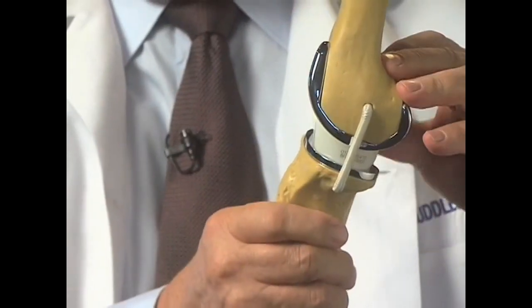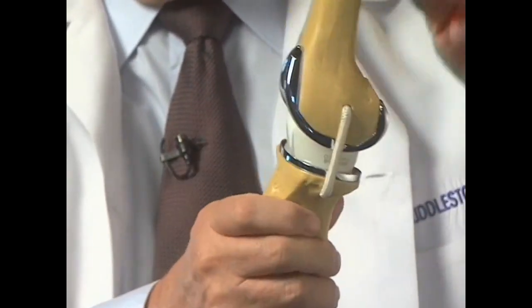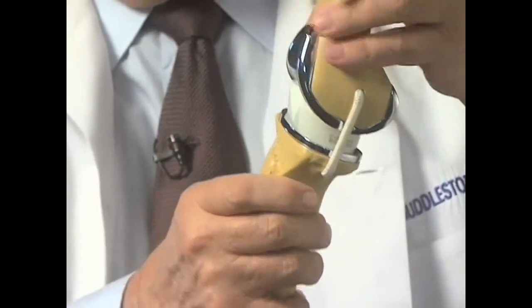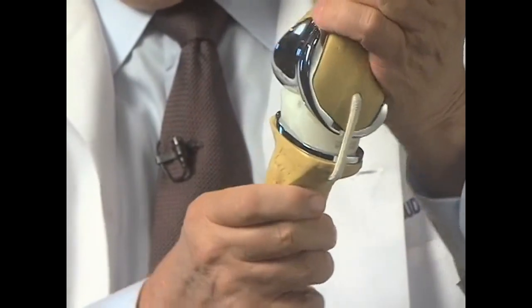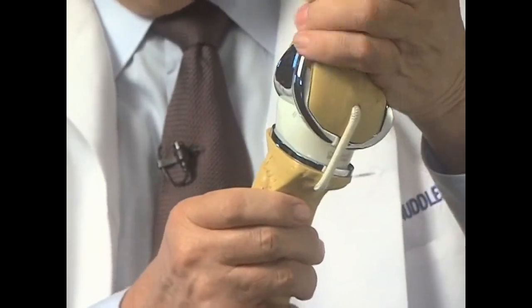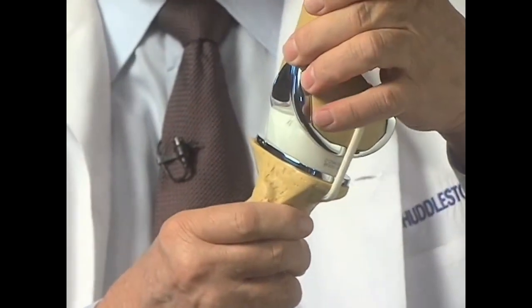This is a very special knee because it has what's known as a mobile bearing — the bearing itself is free to move. Most knee replacements just work like a hinge. In a mobile bearing knee, the bearing is free to rotate so that you have bending motion and you have rotating motion. That gives a better range of motion, and it also gives a more natural feel to the knee.